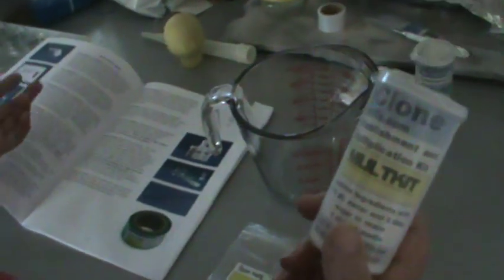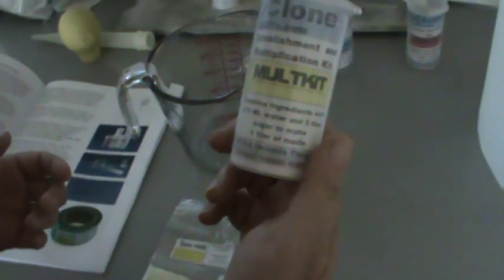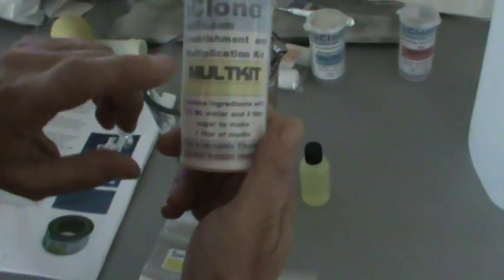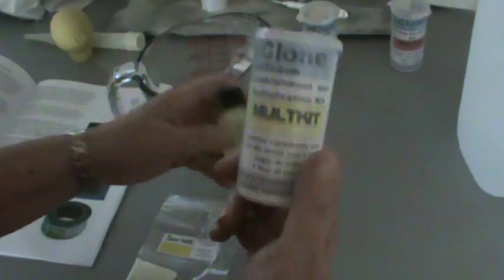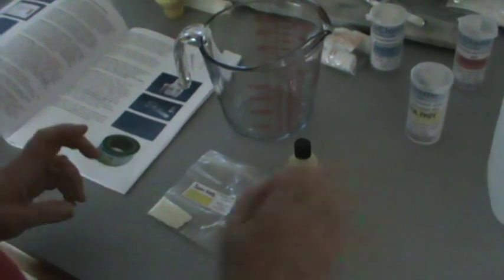If you've seen any of his videos on YouTube, he had it packaged differently on the video, but here he's combined everything in this nice little kit so that it's good for one liter and all you add is the water and the sugar.